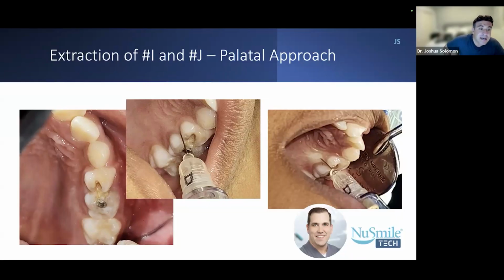Hopefully everybody understands that. You can still give an injection this way, but there's a reason why we attempt to give that stage 1 horizontally, and it just has to do with you have less of a chance of touching that periosteum when you give it in a horizontal approach. Now, if you get experience here, I don't have a problem doing this.